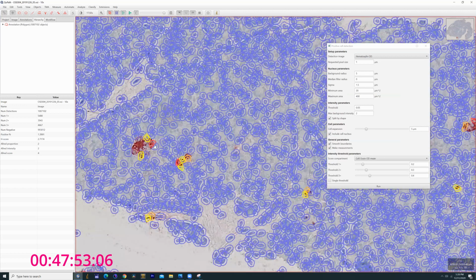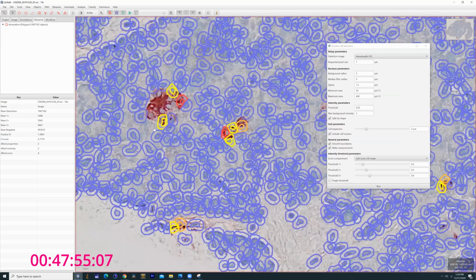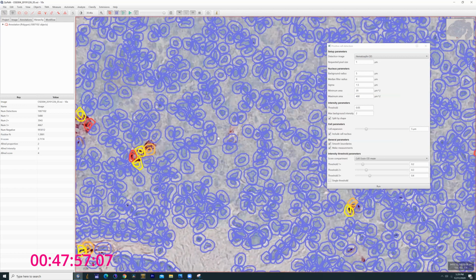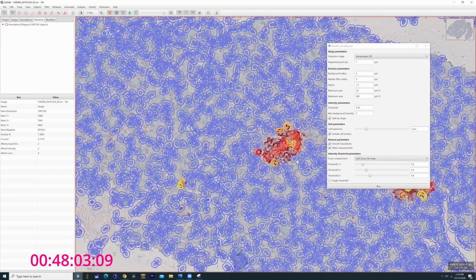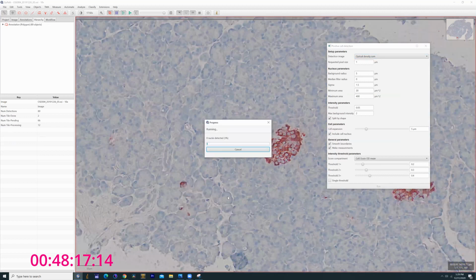The problem with the secondary is you tend to lose a lot of the shape of the actual cells in the scan, and so it just becomes kind of messy. I'd rather preserve those islet structures, areas where you have heavier precipitant formation, and have a few negative connective tissue counts, than risk losing my islets in this case.